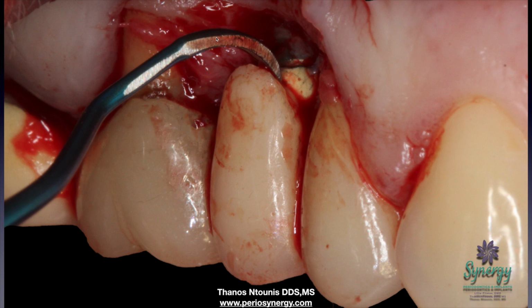A point that I'd like to make about my flap design: this flap design is a full-split flap. It has a full thickness portion on the very top, as well as a split thickness portion as we move further up. The reason for that is I always like to retain the privilege of introducing connective tissue grafts or other types of grafts that need the split thickness bed.